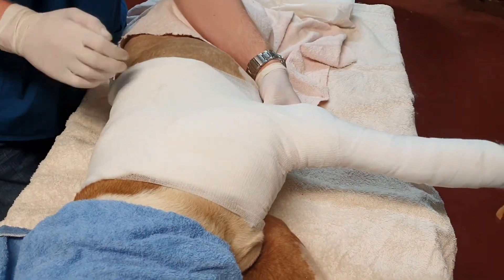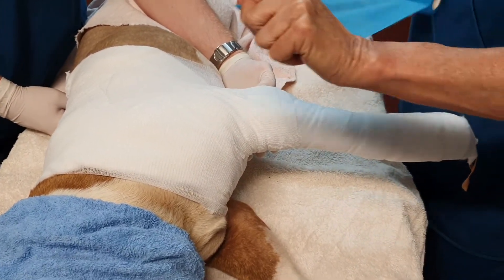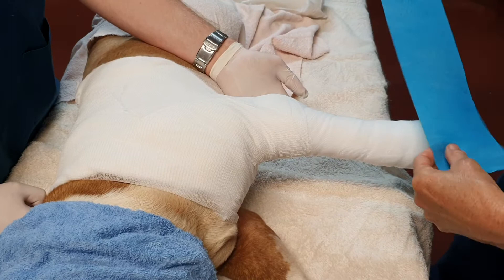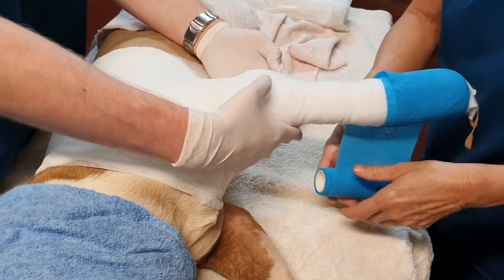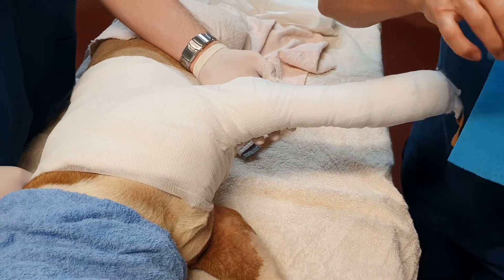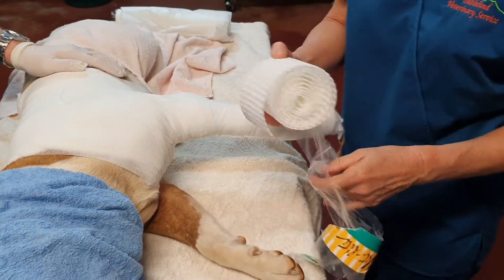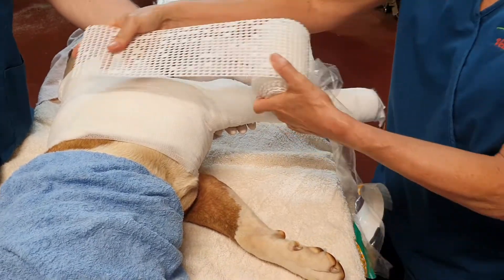Now for the final layer — again, I'm using Vet Wrap, though some people would use Elastoplast. We've actually forgotten one very important bit: the splint. So at this point we will get our splint material. You can use the thermoplastic or the thermoresin. For today's demonstration I'm going to use the thermoplastic.